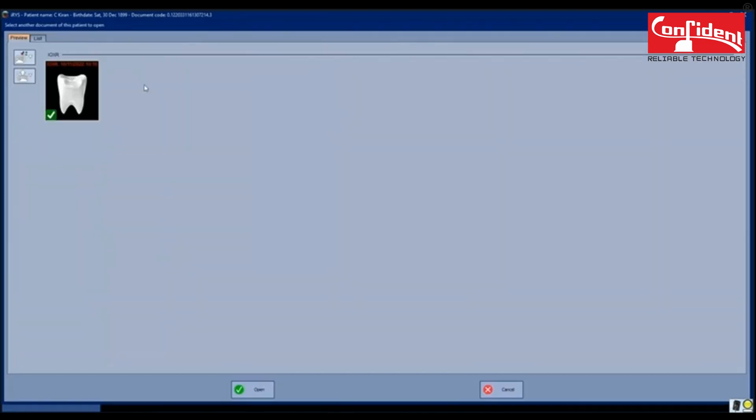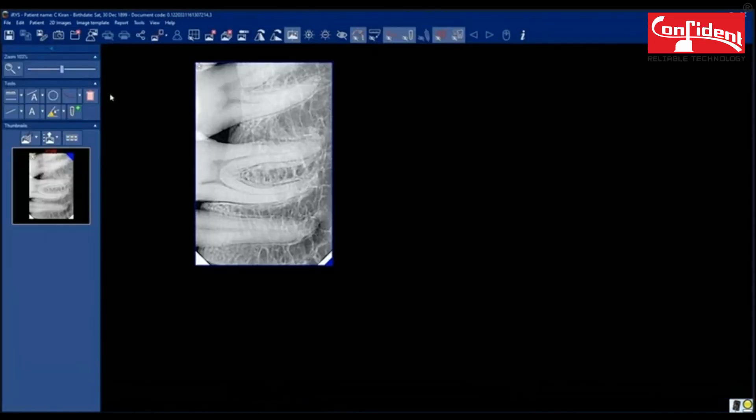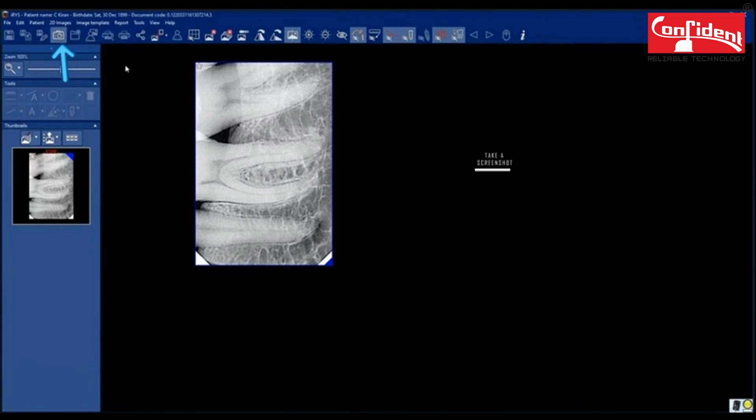You can add more images to study using this link. Select the images you want to add and click open. The selected images are added to the list.